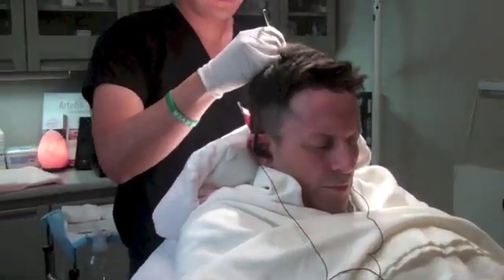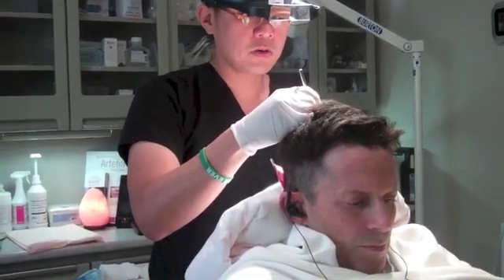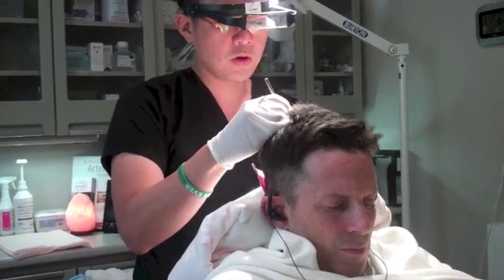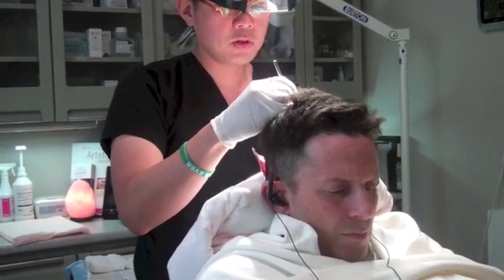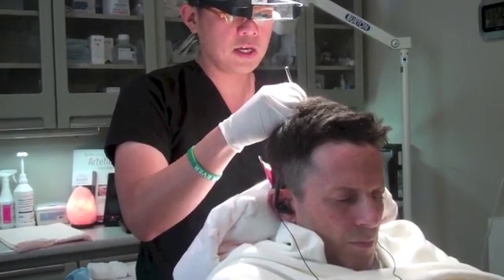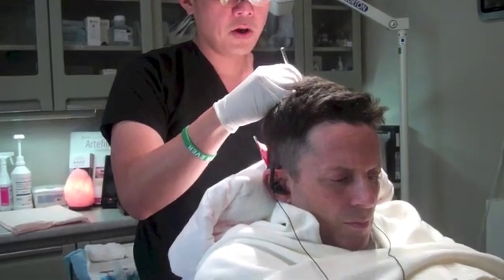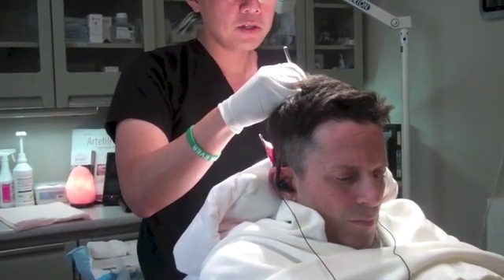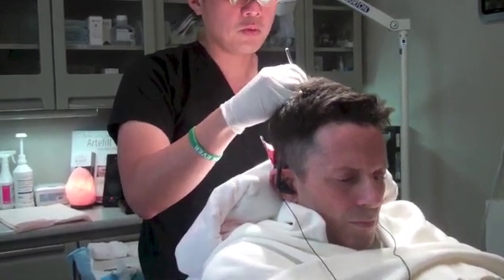We've finished the harvesting part with the robot, and now comes the artistic part where I'm actually designing the recipient sites — what the grafts are going to go into. What I'm trying to do with the design is really camouflage these bad plugs from before, create some visual density, using what's called a micro-punch instrument, which is really good for follicular unit extraction in robot cases because it matches the size and dimension of the robotically harvested FUE grafts. They also help physically shrink down baldness.